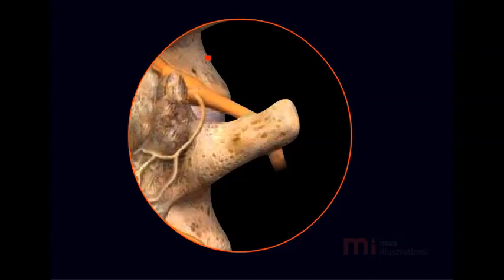Facet joints are little joints situated throughout the spinal column. Pain signals from facet joints are carried by small nerves called the medial branches. Radio Frequency Treatment disrupts the pain signals carried by the medial branches.